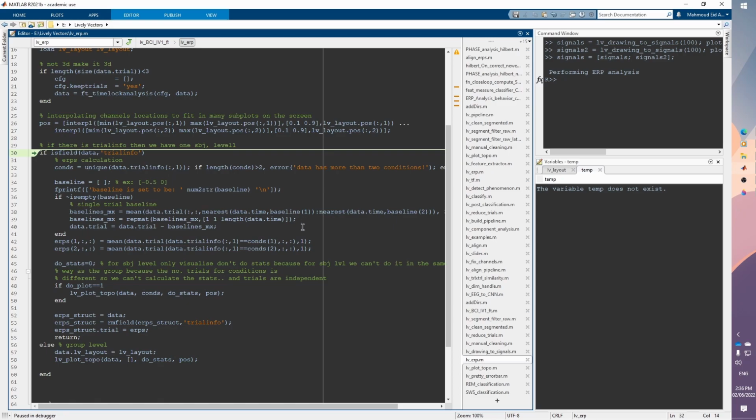Here we are differentiating between 2 things: whether we are working on the participant level, so the subject level, and we say that this is level 1. This is basically a convention for naming this kind of analysis. So you might say it's level 1 or level 2. Level 1 basically when we are thinking about participants, level 2 when it's on the group level.